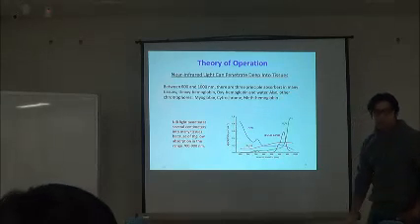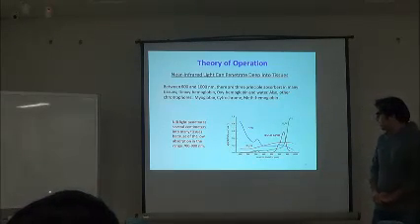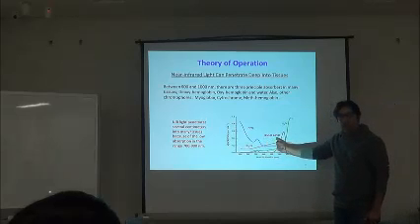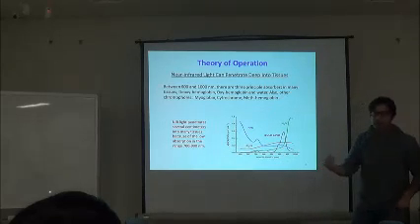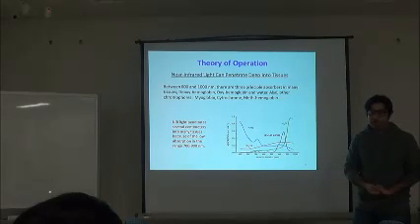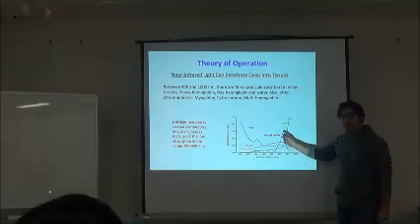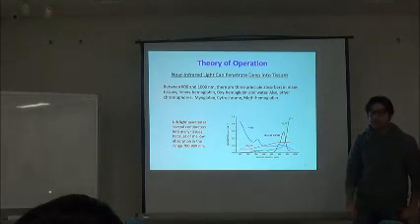Does the bulk lipid mean the protein? Yeah, lipid means the cholesterol. In a human body there is some cholesterol, but in the brain, the level of this cholesterol is quite low. There is very little cholesterol in the brain. So potentially we can ignore this in the context of brain imaging.